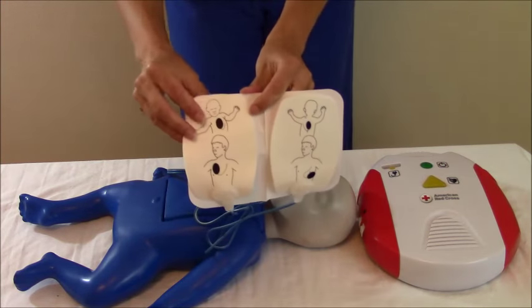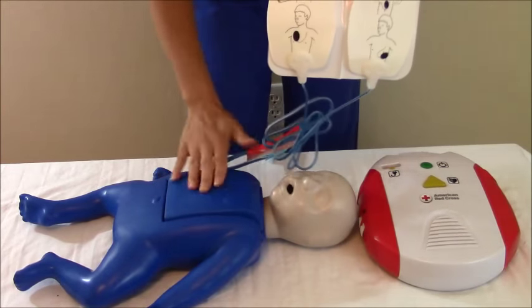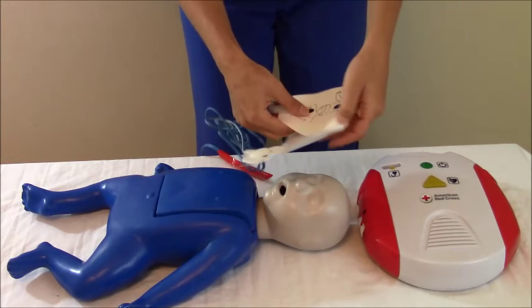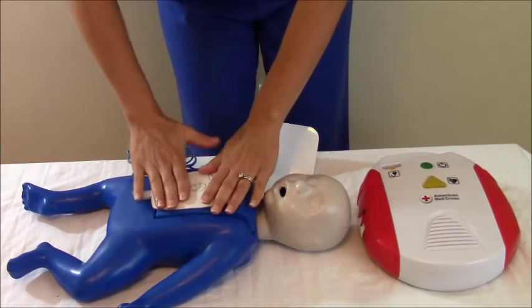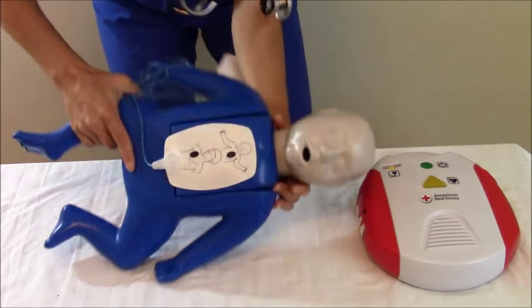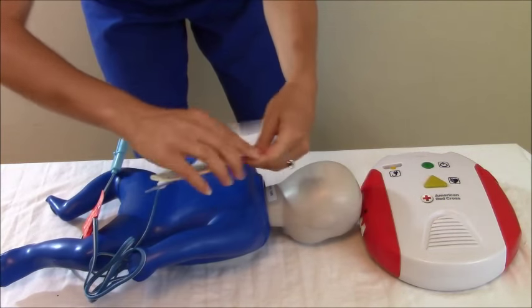The pads will tell you where to put them. Because this is an infant, we're going to put a pad on the front and then put a pad on the back. You're going to put it on the front and press it down firmly. And then as you turn the infant over, support their neck and flip them over, and then put it on their back.